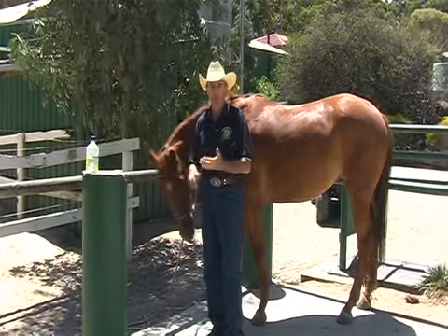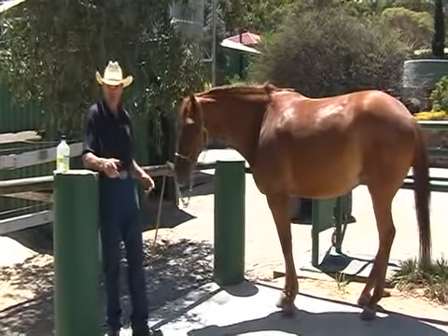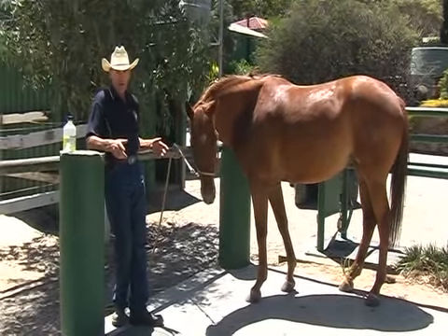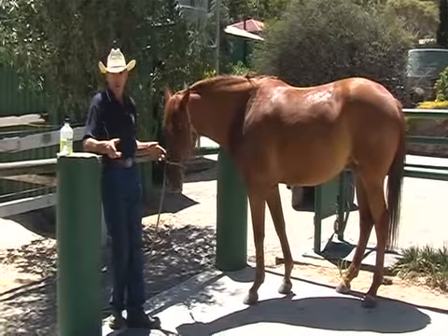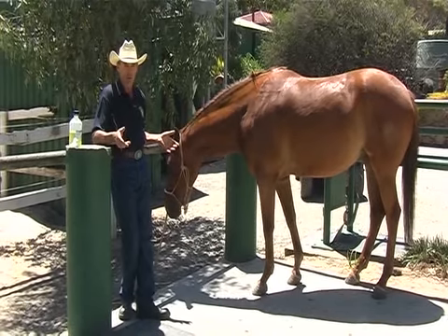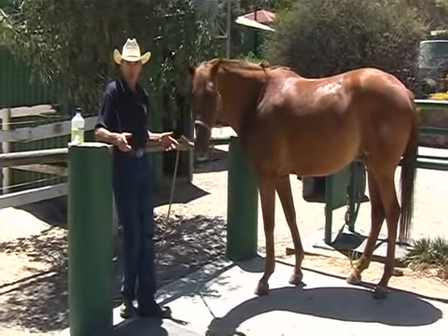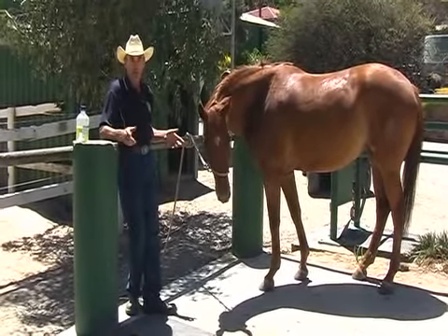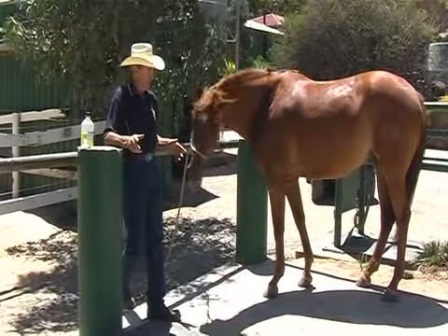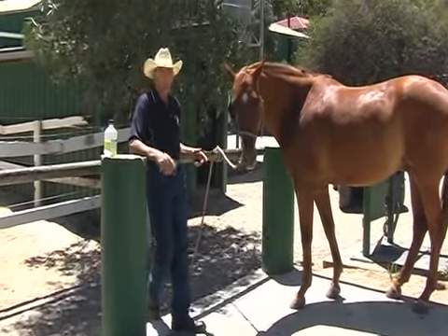This week it's a result of several letters that I've had recently about people trying to give shots or needles to their horses at home, and they're having a lot of trouble, especially with unbroken ones, weanlings, yearlings, trying to give horses their tetanus or strangles shots, and they're generally doing it by trying to inject horses in the neck. Now, a lot of vets recommend that, especially to amateur owners, that they inject into the necks of their horses, being the safest place.